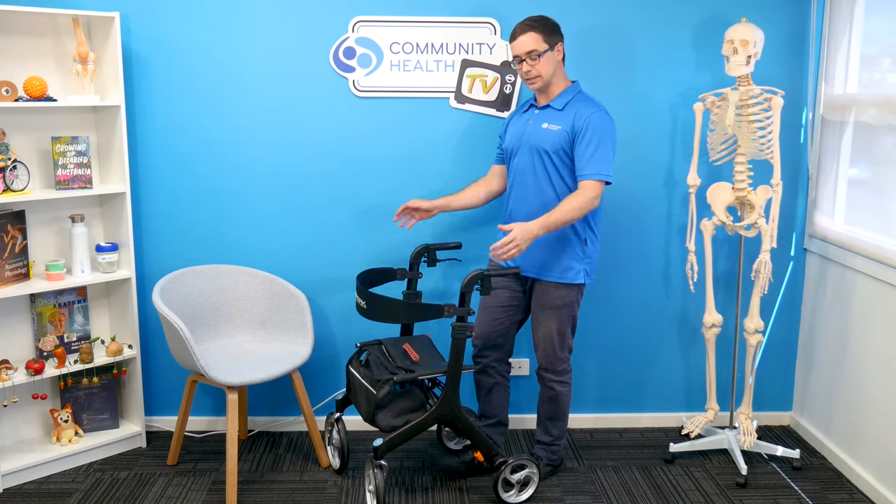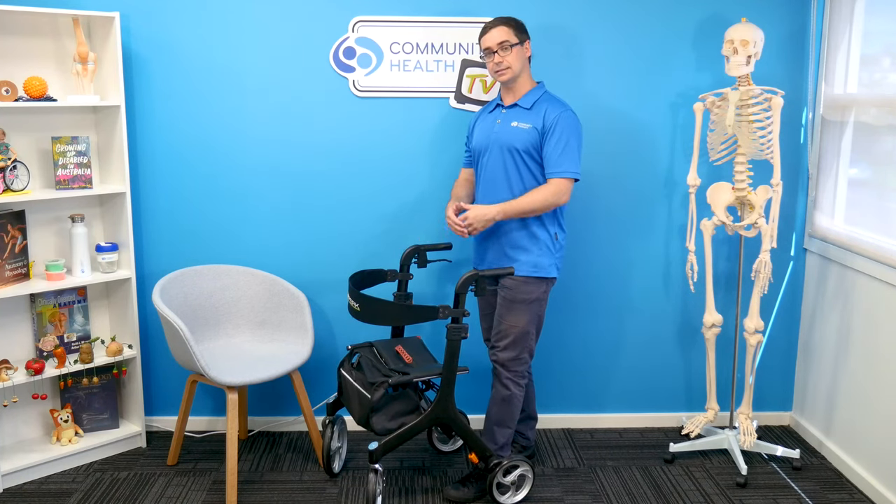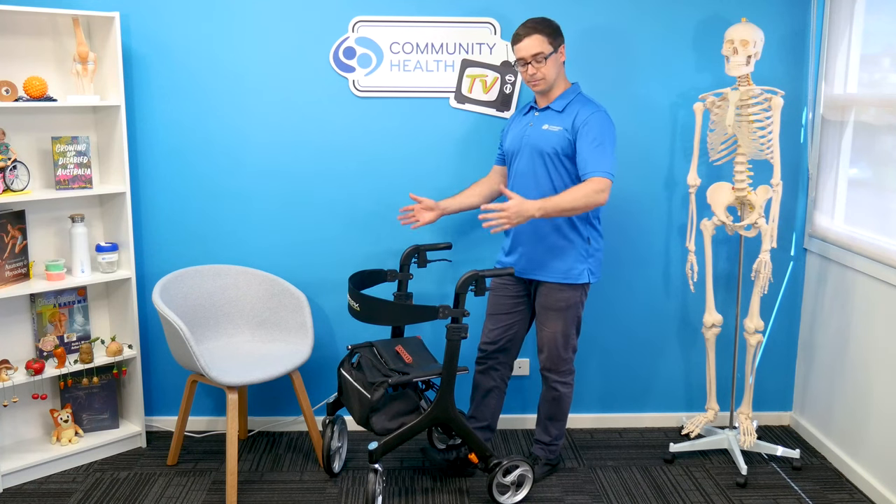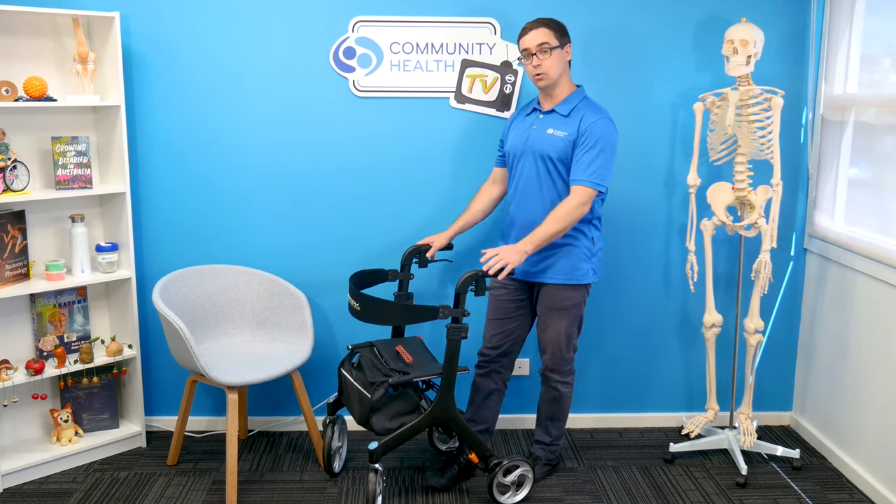There's a range of things to consider, from price — because models like this can be expensive — all the way through to all types of dimensions, types of wheels, types of brakes, how they fold, etc.